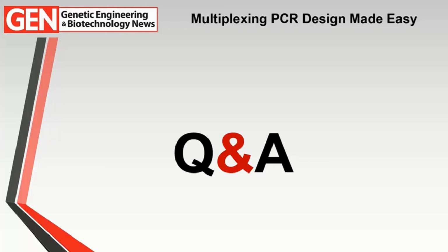Arjang? Yes, from our platform point of view, what generally limits the level of multiplexing is not the computation and the primer design part of it, but how much product you need to create. In molecular diagnostic assays like ours, in order to do the detection, you need a minimum level of amplicon generated. In our case, if you want to drive the hybridization and detect them on the array, you need about 10 nanomolar per plex. If you run the numbers on the capacity of PCR and how much product you can create after 40 cycles, that ends up being more than 50-plex, or I would say 70-plex would not give you that many targets. That's the limitation of PCR.